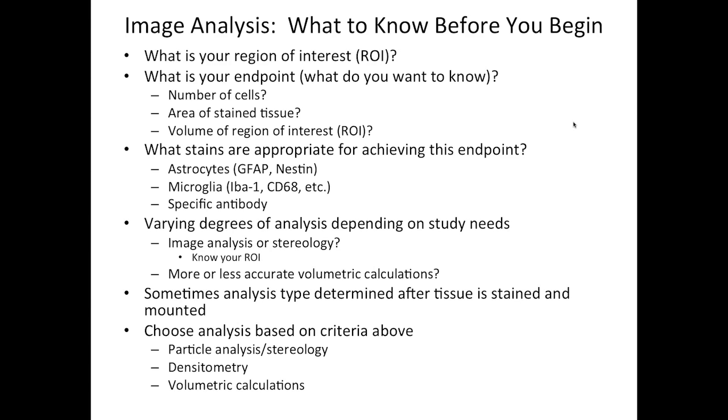Another important factor is, what's your endpoint? For your specific study, what do you need to know? What kind of information do you need from the stained tissue? Are you looking at number of cells? Are you looking at an area of positive staining in the tissue? Maybe you're interested in more of volumetric calculations. So two very important things to consider.